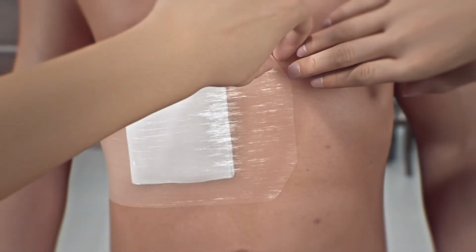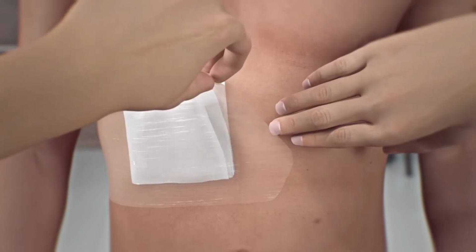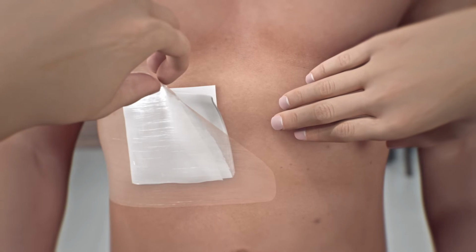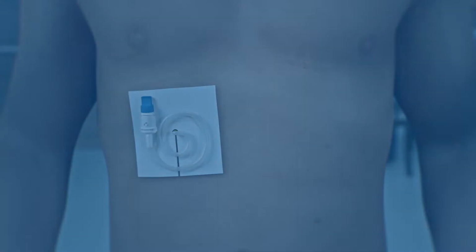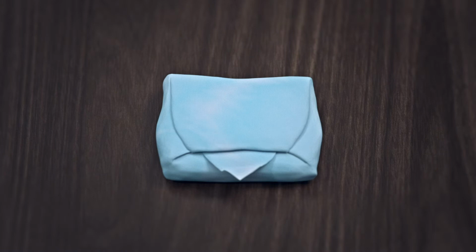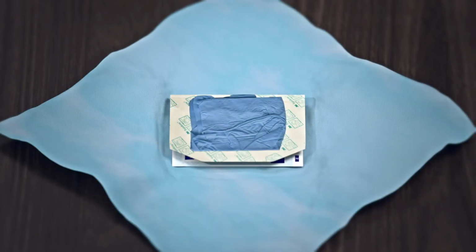Remove the adhesive dressing from the patient's catheter site by slowly pulling the dressing away from the site, and then discard. Do not pull on the catheter while removing the dressing. Open the redressing kit using sterile technique by carefully unfolding the sterile blue wrap to create a working area. Leave all of the contents of the kit on the blue area. Do not touch any of the contents with ungloved hands.